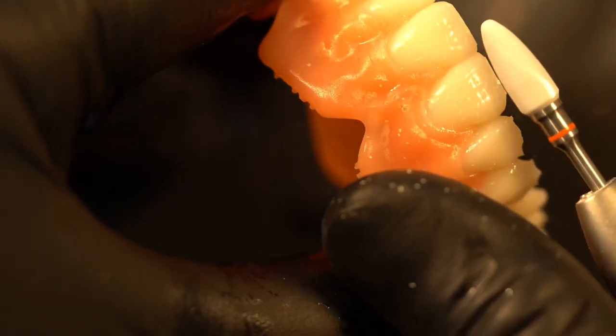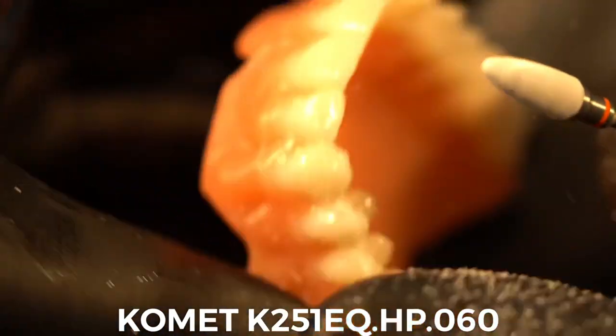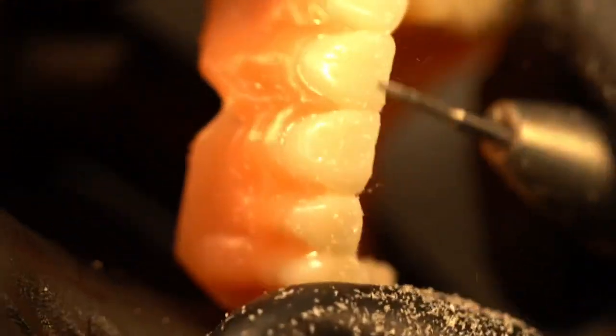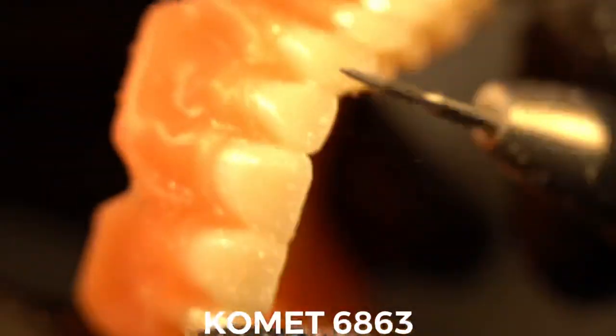The next step is to trim off the supports that were remaining from when I broke them off initially. I use this zirconia burr — it's actually made out of zirconia but specifically designed to trim acrylic and 3D printed materials. The flutes are really cool; it's a biphasic flute structure where the tip is smooth and the base is rough, so they just tear off those supports.